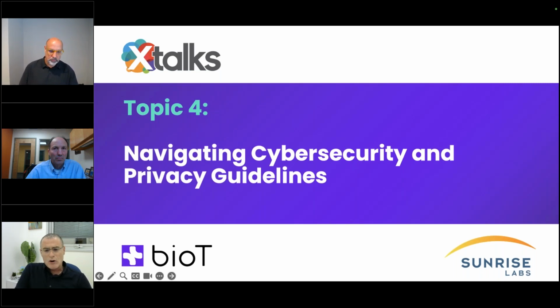And then you need to show how you are managing vulnerabilities, because eventually you will find vulnerabilities, or someone will find vulnerabilities. That's basically how you manage your SBOM, software bill of materials, and how you manage your updatability plan. Once you identify a threat, and it's a critical or major one, how do you update it in a timely manner?